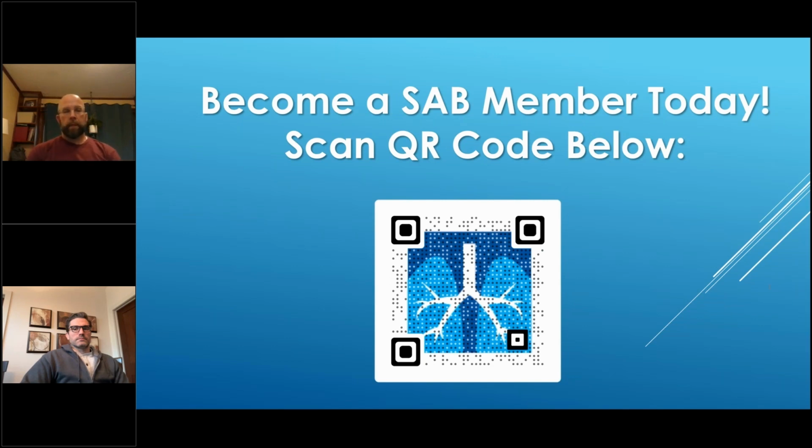Perfect. Okay, next question was, does the Body Vision system work with Super Dimension? There's no reason that it can't. I guess, Mike, you can answer this too. It will not interfere with Body Vision. If you are using Illumisite, I don't believe you can use both Illumisite and Body Vision together. That part would interfere. If you have non-Illumisite, Body Vision can work in conjunction with it. It will not interfere with the Body Vision board.